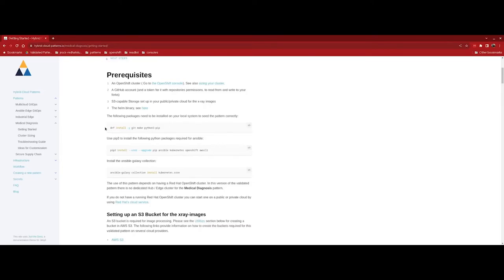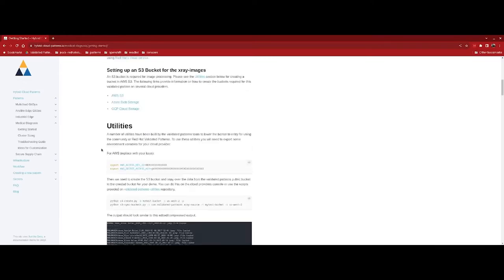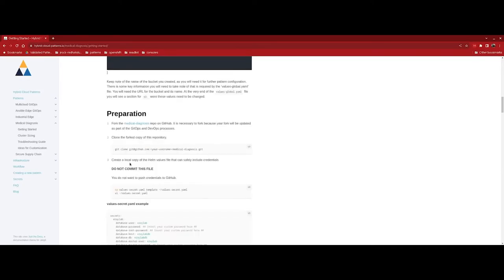Next, we'll need to install the helm binary on our control machine, and we'll need to install some packages using dnf or homebrew or whatever our package manager is. Next, we'll need to install some Python dependencies to support the kubernetes.core ansible galaxy collection. Please note that ansible is only used during the bootstrapping of the pattern, and once the pattern has been initialized, the state of the cluster is managed through the GitOps controller. To set up the S3 bucket for x-ray images, we provide a utilities repository that you can use that has some programs to create the bucket as well as the bucket policy.